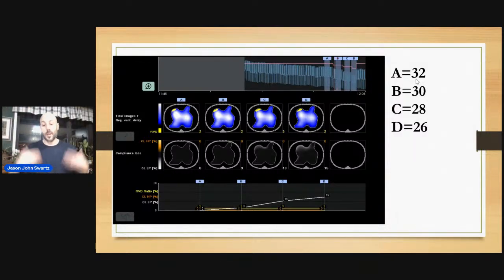So by having eyes inside the lung, by having regional compliance, distribution of ventilation, dynamic trending, comparing, visually seeing things, you're able to go safely, and also as an RT to protect yourself, to have all of the data.